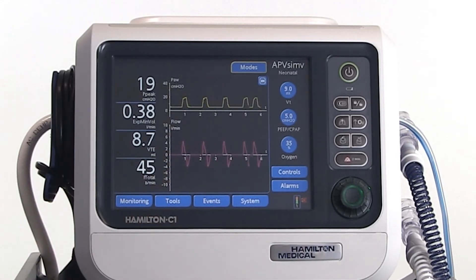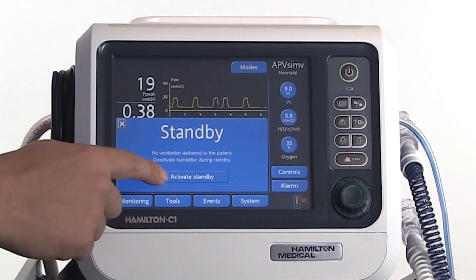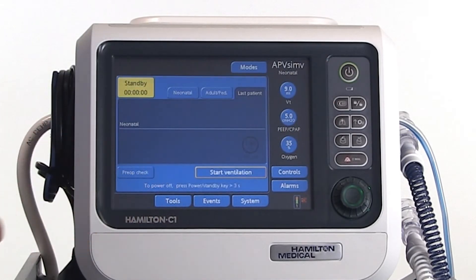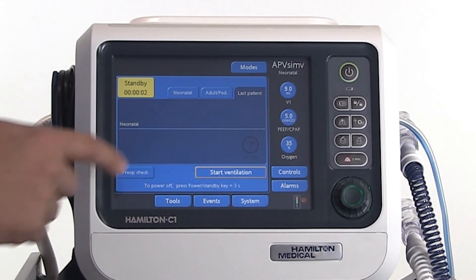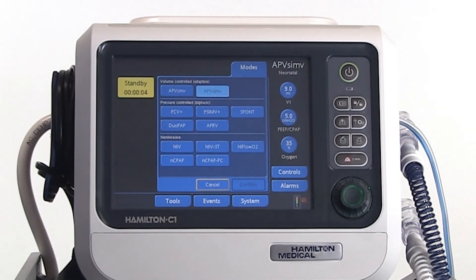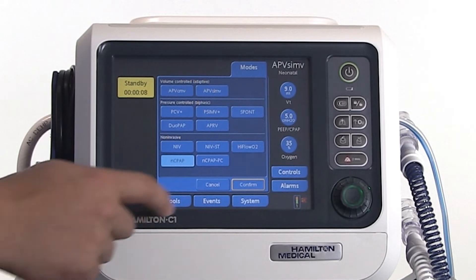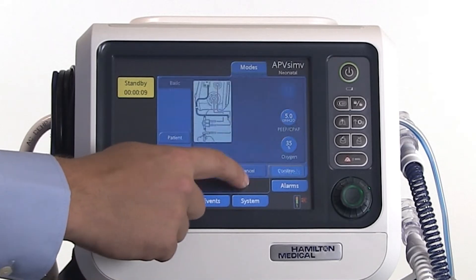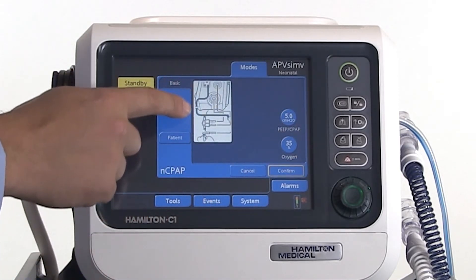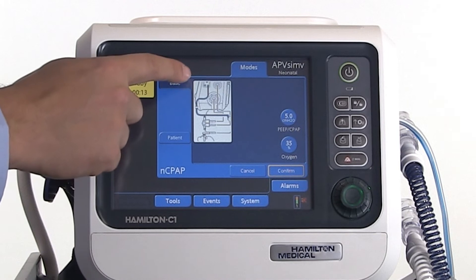To switch to the NC-PAP modes, you need to go back into standby. Open the modes window again and select the desired NC-PAP mode. Make the necessary changes to the system according to the instructions on the screen.